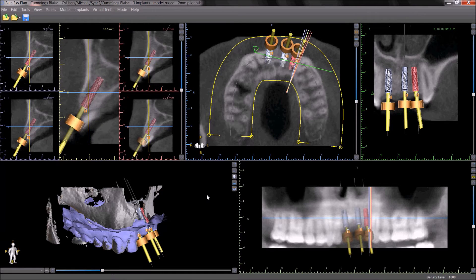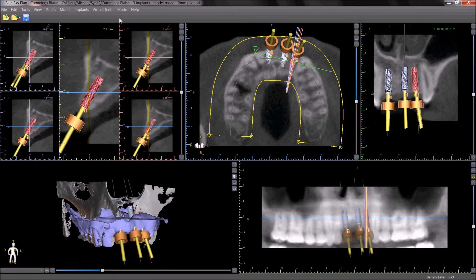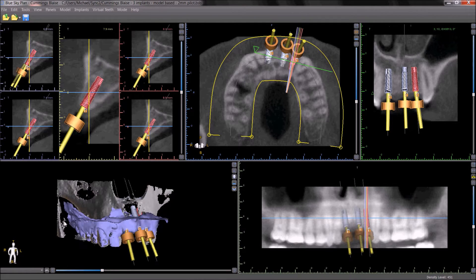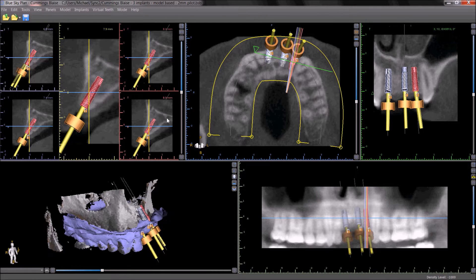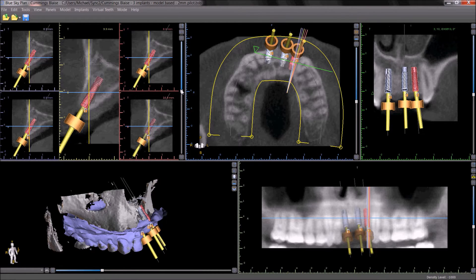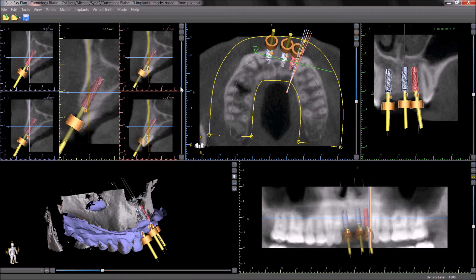The viewing mode has been created to allow users to quickly and easily see and review cases. The viewing mode is currently being viewed on the screen and allows all the functionality for users to view cases, analyze the 3D, use the different 2D functionality, but will not allow a user to make any changes.